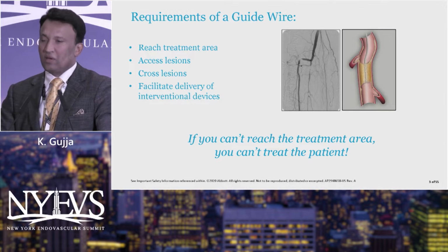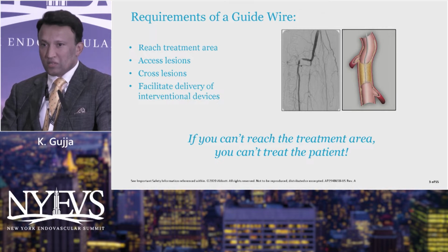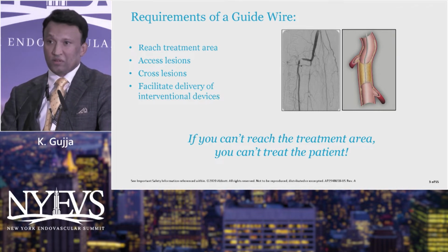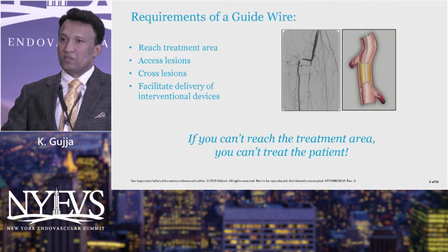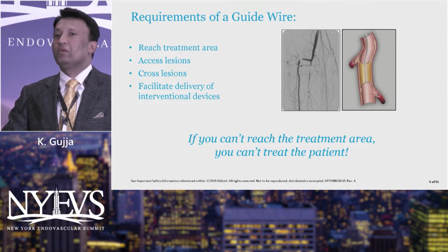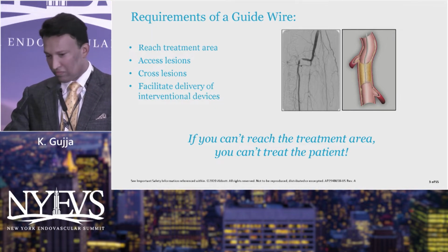Everything depends, the guide wire, most of the time it depends on what kind of occlusion it is. Is it a long segment occlusion? Is it tortuous? Is it calcified? That's where our things come into play. More than coronaries, if you're interventional cardiologists, wiring skills in peripherals are probably a little more difficult and more tedious than coronaries because the segments are very long. Most of your occlusions are pretty long, at least 15 to 20 cm, and then you have very calcified vessels. So it's very difficult to get from lumen to lumen unless you choose the right wires.